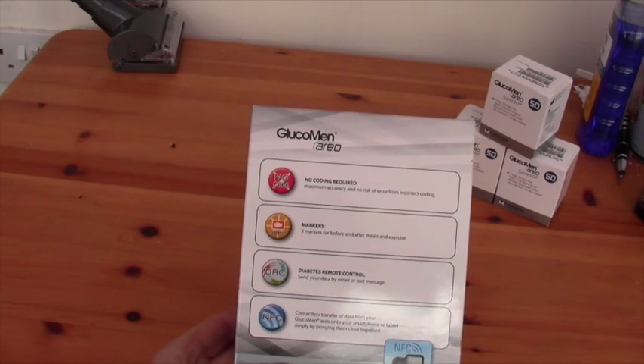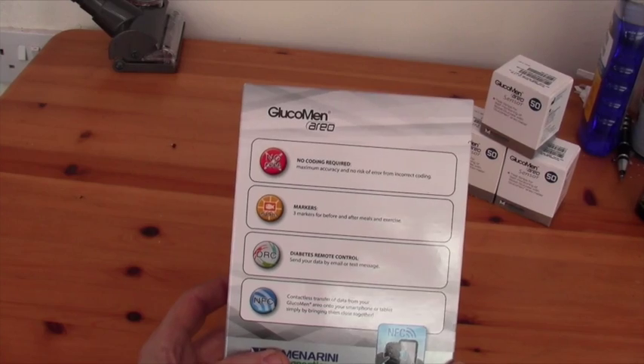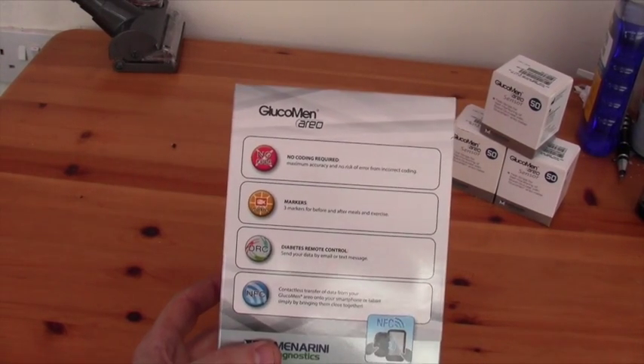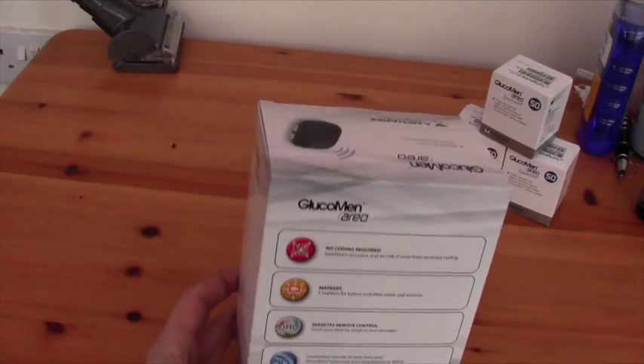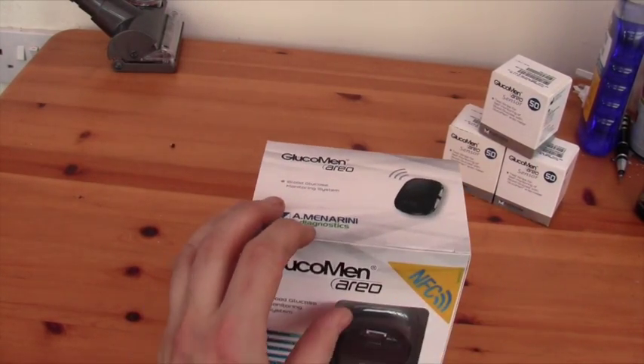Diabetes remote control literally just means that you can email your results if you're using the app, and like most other meters you can add markers for before and after meals. No code — most meters conform to that nowadays.